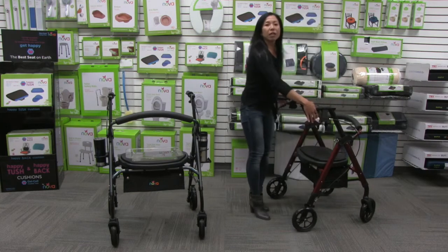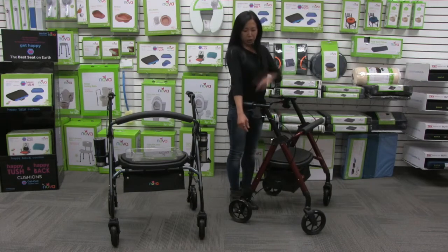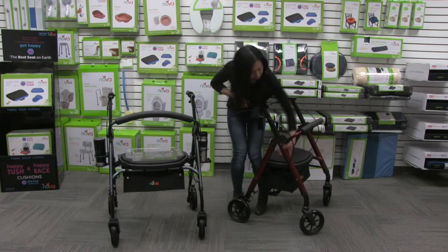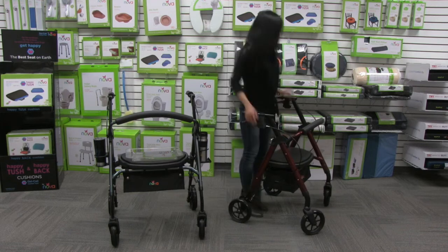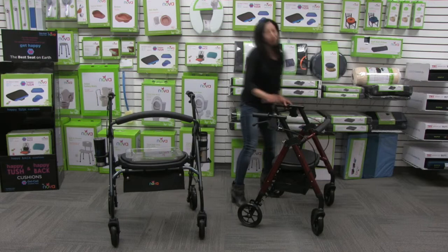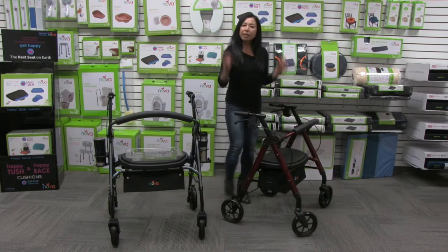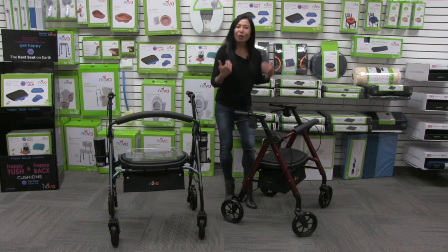Now I'm going to adjust the handles — right now they're too tall for me. I want to adjust the handle to approximately my wrist height, which will give me a nice 30-degree bend in my elbow. I'll lower the handle — that feels about right. Now I'm walking with good posture and a slight bend in my elbow. You can see how quick and easy it was to get the perfect fit on this Star 8.